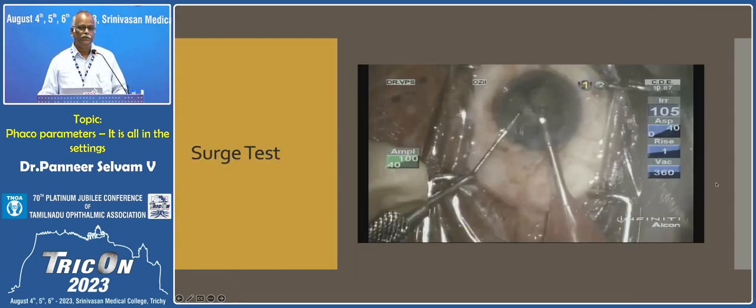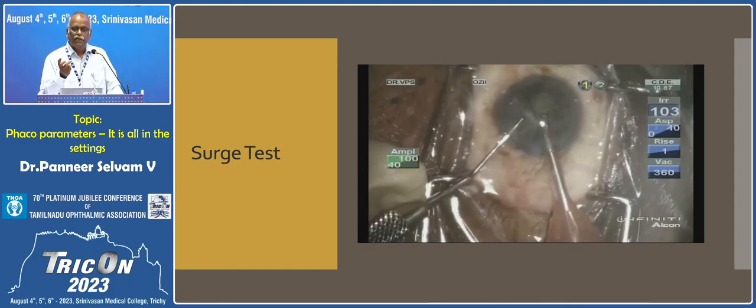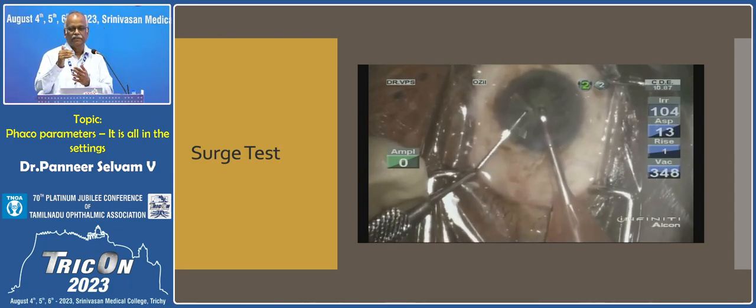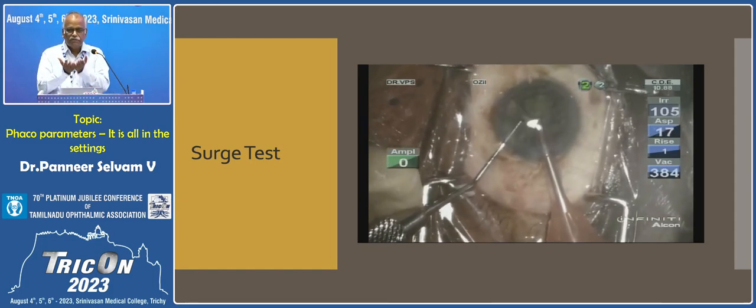Next is surge. You are given a machine, any machine, and you should know its maximum capability because you want to prevent surge, how much the vacuum can be set, and it can be tested. Suppose you do the fragment removal. Start at a lower level. I have set it at 360, and then you start emulsifying that piece. There is no surge. Then you raise it to 400, 450, 500. Each time look for the surge. It's not because of the other fragments, but there is a forward bulge.